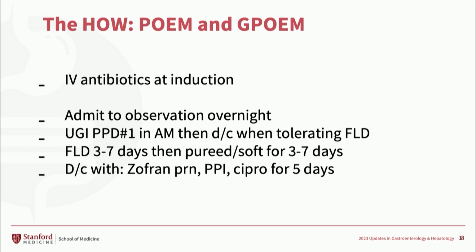Just in terms of our protocol, we do give IV antibiotics at induction. We do admit our patients to observation overnight, get a swallow study post-procedure day 1 in the morning, then discharge once tolerating a full liquid diet that post-procedure day 1. And then depending on symptom profile, type of achalasia, dilation of the esophagus, patients are generally on a full liquid diet for 3 to 7 days and advanced for additional 3 to 7 days before trialing more regular food. And we do discharge our patients routinely with Zofran, PPI particularly for our POEM patients, and then Cipro for several days.